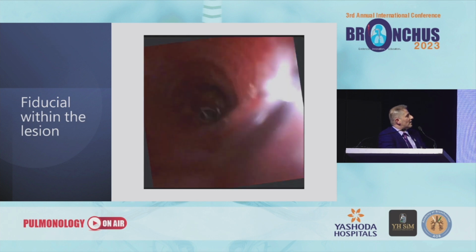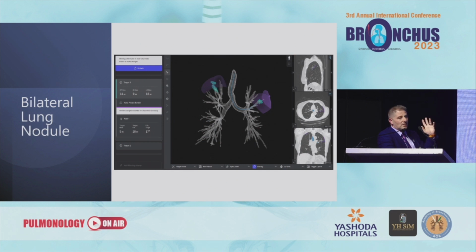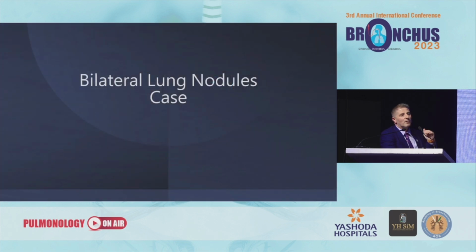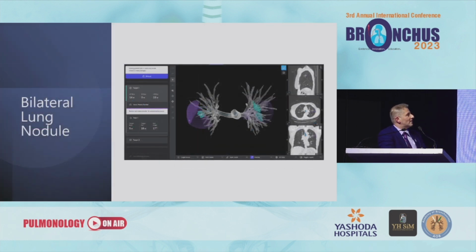advantage of using real-time imaging is that, as mentioned in previous talks also, we can sample both lungs. And not only for confirmation of the location of the lesions, but also to help us rule out any pneumothorax on the first side before moving to the second side.